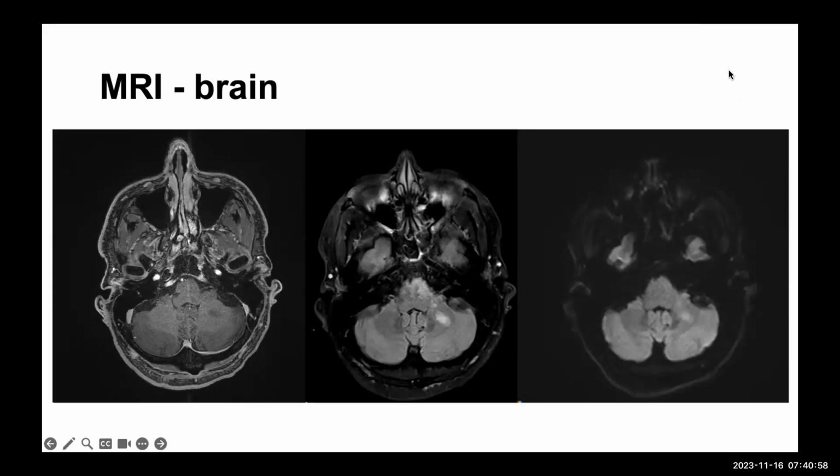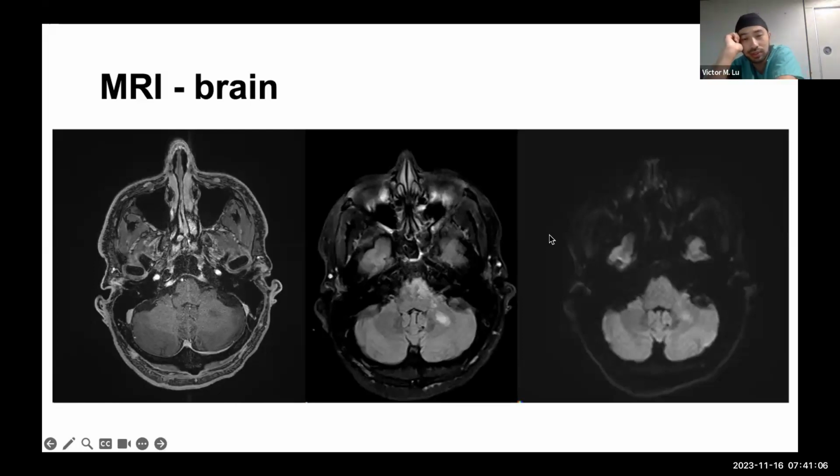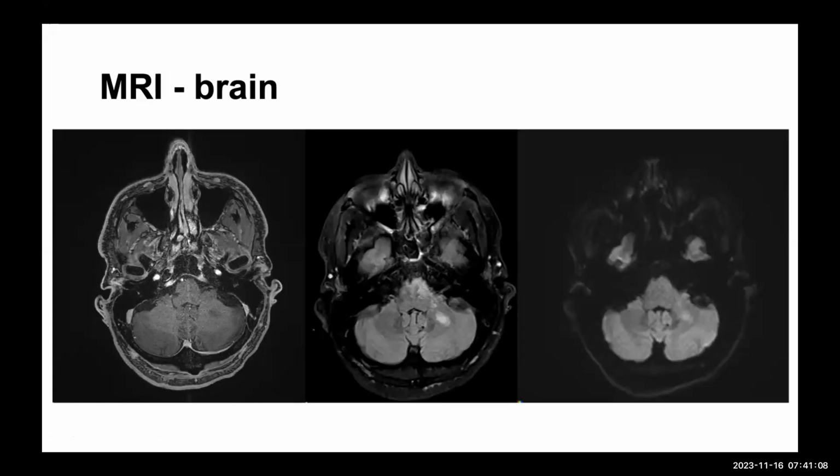Yeah, so again, on FLAIR, I still see the hyperintensity in the left cerebellar hemisphere near the CP angle. Anywhere else, or is it just in the cerebellum? I also see some extending out. I can't tell if this is all one hyperintensity, but I also see some with the brainstem. Otherwise, on the FLAIR, I think those are the two that are jumping out to me right now on the screen.